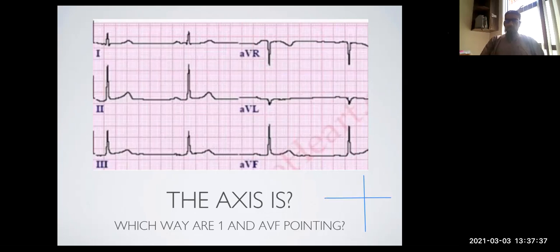So here we are going to put lead I. Oh, sorry. Let's just put that there. Lead I. Just drop the size of this, maybe. Okay, so let's put lead I there. Let's put another one. And let's put AVF down there. All right, so we've got lead AVF that's sitting over there.